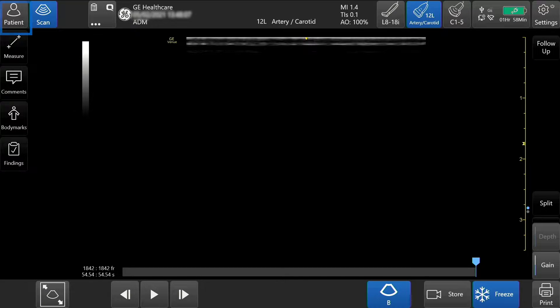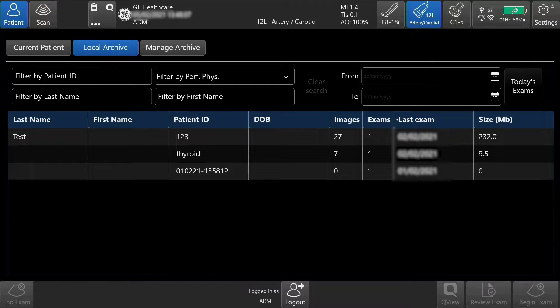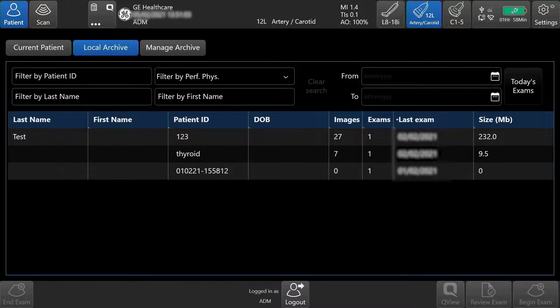To review an exam, tap Patient. On the patient screen, you will see the local archive tab. Here you will be able to search for patient exams and review exams.